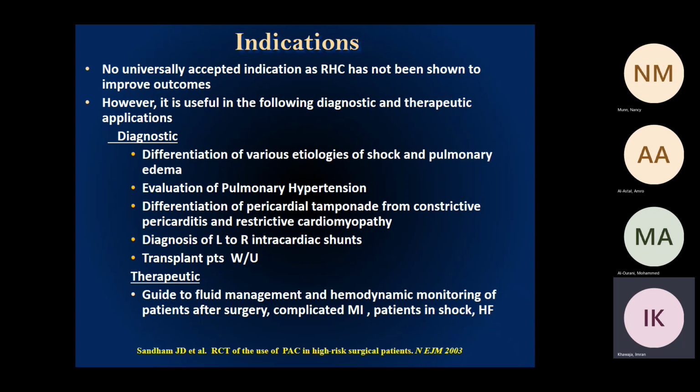Nonetheless, Swan-Ganz used to be a very common procedure. When I did my critical care, we did it daily, and when I was on call, we would have multiple Swan-Ganz placed. The situation has changed since then, and you don't see it done too often. These days it is mostly in evaluation of patients with pulmonary hypertension, and sometimes in the cardiac ICU on patients coming off major cardiac or vascular surgery.